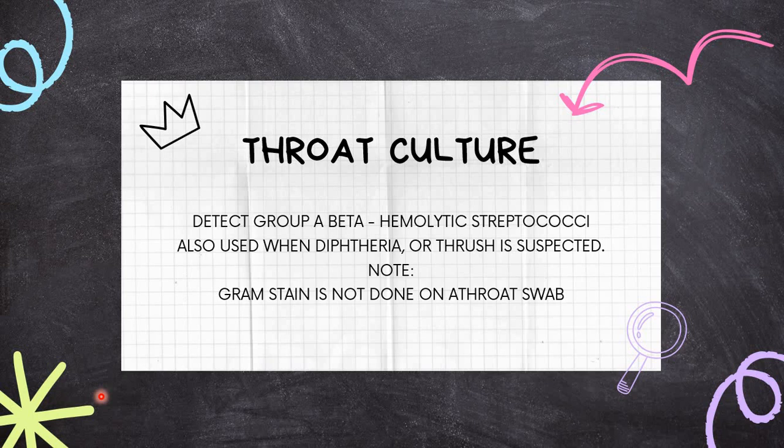The material on the swab is inoculated onto blood agar, and if colonies of beta-hemolytic streptococci are found after 24 hours of incubation at 35 degrees centigrade, a bacitracin test is usually used to determine whether the organism is likely to be group A streptococci. If growth is inhibited around the disc, it is group A streptococci.